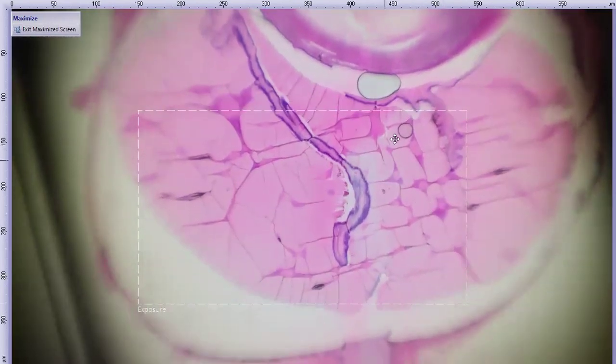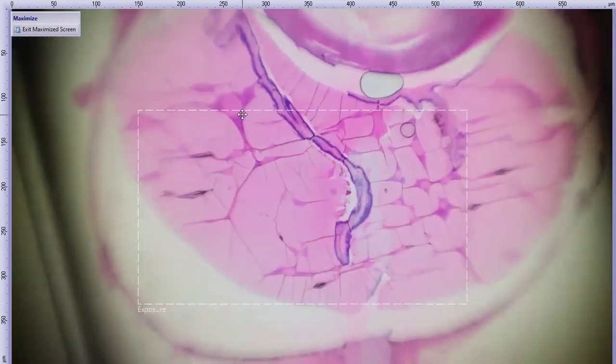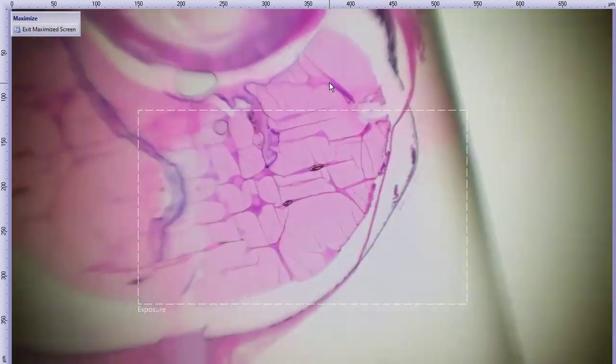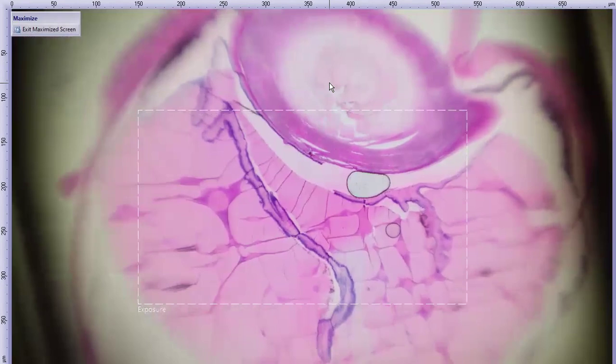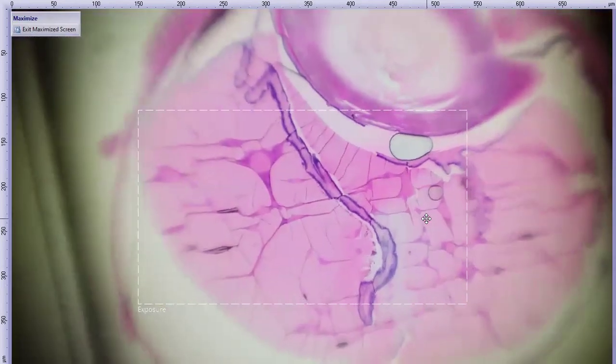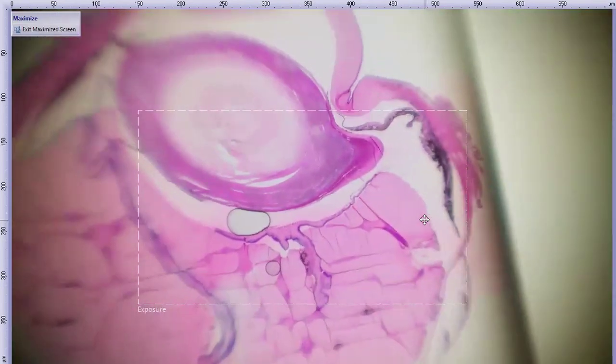So all these cracks, again, these are all artifacts, but they were caused during processing of the tissue. That proteinaceous exudate was so dense that during processing it contracted and kind of cracked. That's why it is separated from the choroid and it kind of separated from the lens here. So imagine that normally this was filling the whole thing. But it was so dense and so proteinaceous that it sort of congealed and separated from the rest, and you can see these cracks here. So the cracks here are all artifact, but they go along with the gross image that we were seeing.